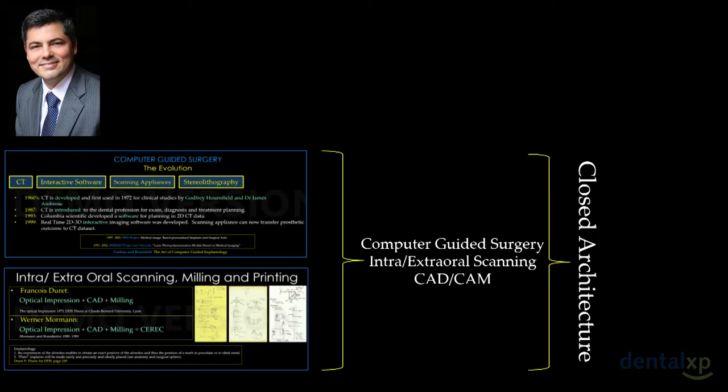So when you put together the creation of the CBCT and the creation of the digital technologies, being scanning, design, milling, and printing, what we have to think of is the creation of something that has been the dream of the dentist: putting the implant, putting the abutment, putting the crown the same day, or prepping the tooth and delivering the crown right away. And this technology has been available for a long time.